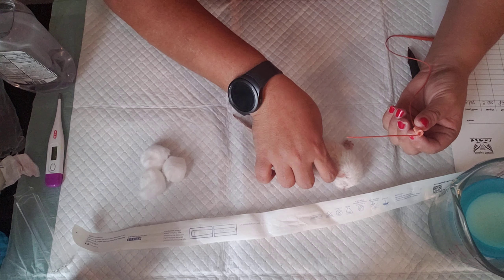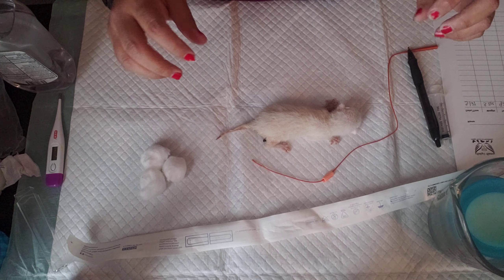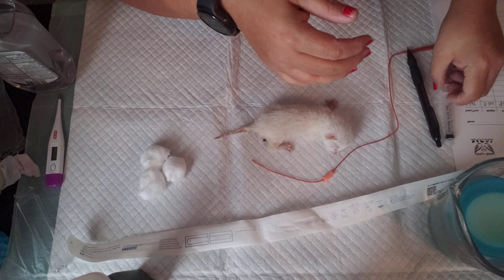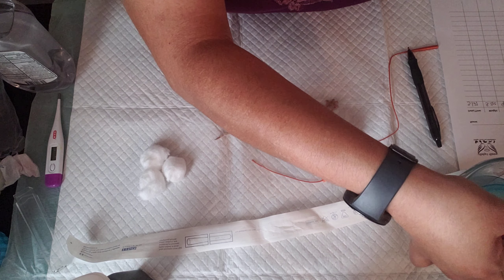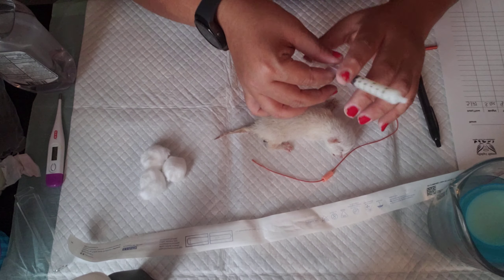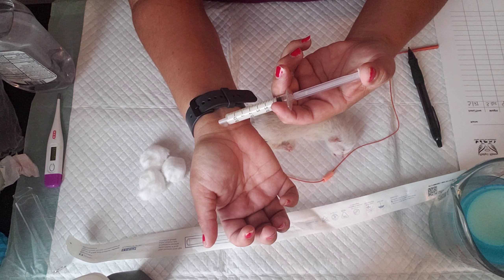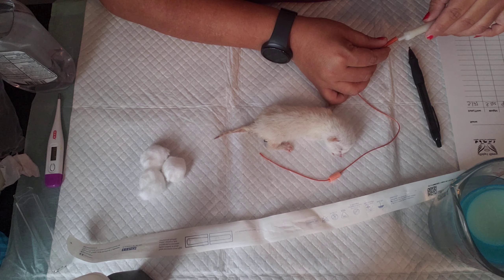Let me disinfect it one more time. Alright, so here we go. It's pretty much one mil per ounce of kitten. You always want to test the temperature — it should be just like for a baby. You don't want it too hot or it will burn them. So, that's perfect.